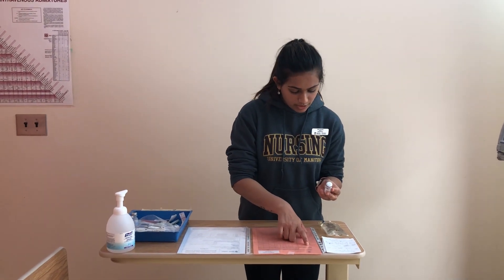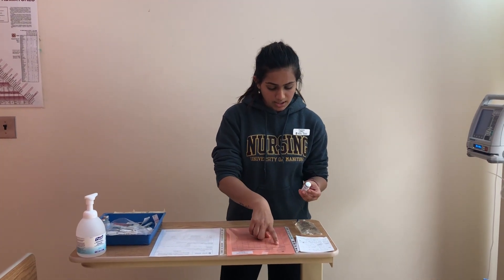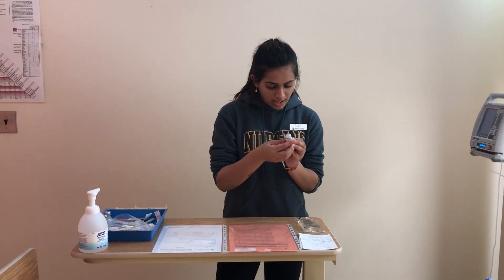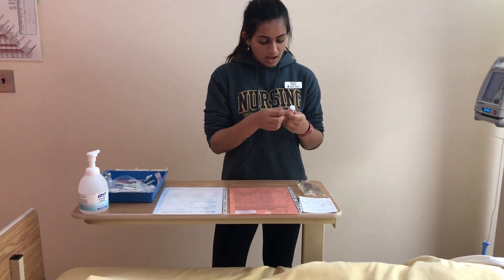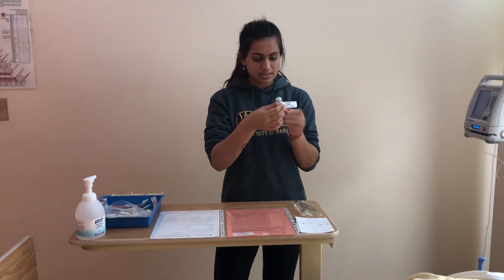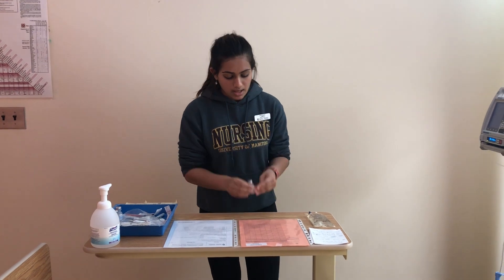The dose is 75 milligrams; however, the dose in the vial is 125 milligrams, so I will need to reconstitute, dilute, and obtain my required dose. It can be given IV, and it's Q6H, so it is ordered for now. Furthermore, the vial seems to be intact.